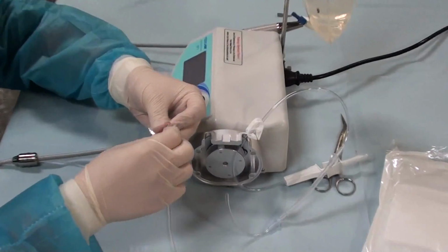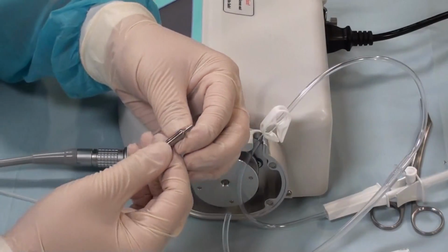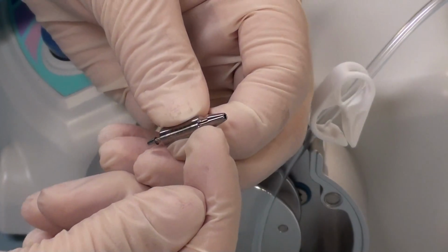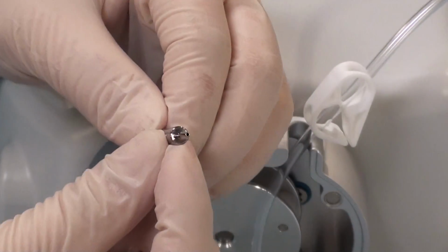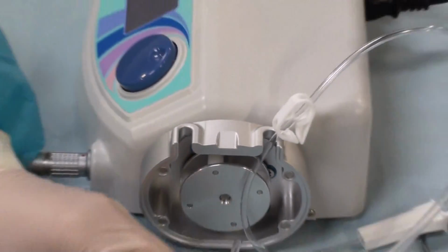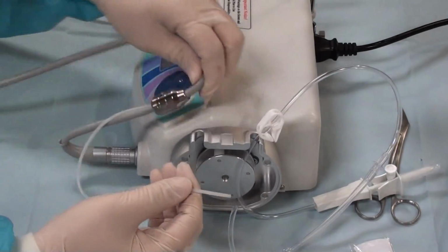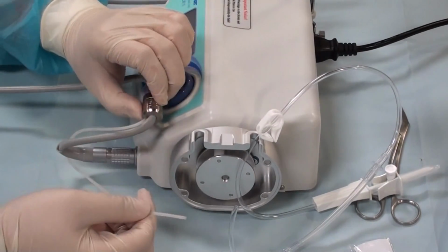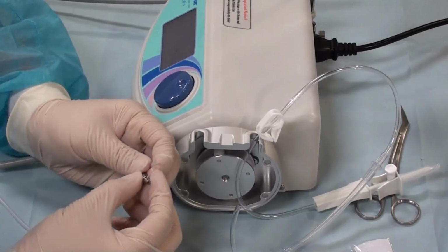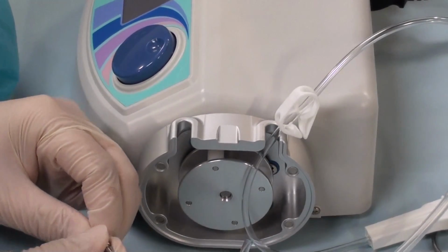and you'll also find a little pump tube connector. It's a metal pump tube connector, and you remove it from the bag, and there are two sides. There's one side that's going to have a thicker nipple and it's going to be wider, and the other side is going to be a smaller, narrower nipple. So you start with the narrow side, and with the handpiece tube, which is connected through the handpiece wiring, and you attach it to the small nipple. You want to make sure that it's in all the way.